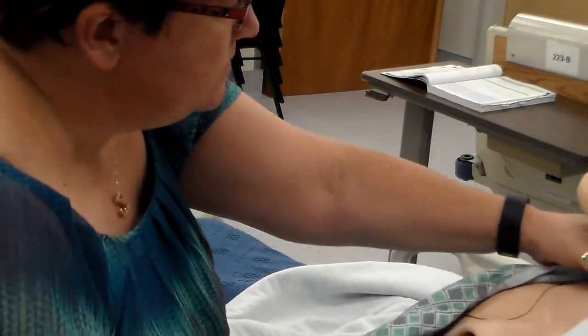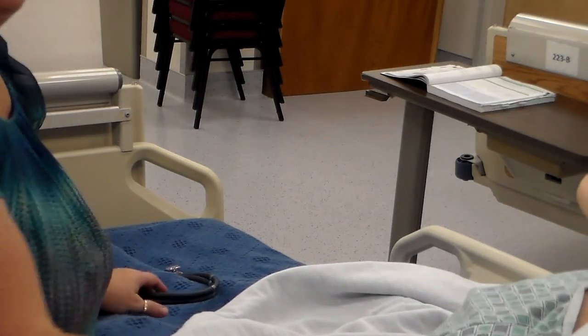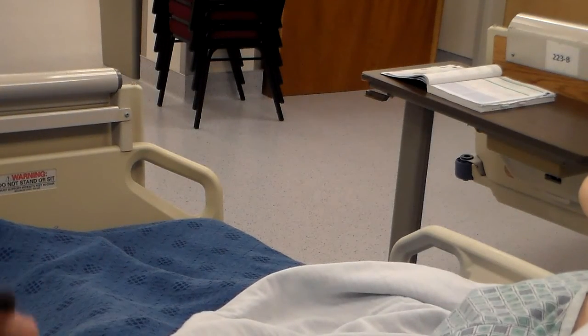All right. So while you're listening to your patient's lungs, you're going to listen for, first of all, do you hear anything? Do you hear that breath going?